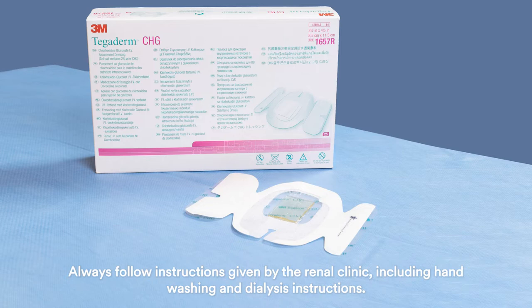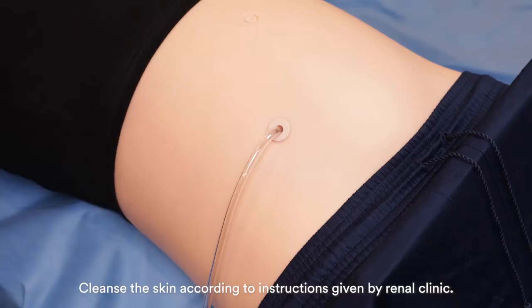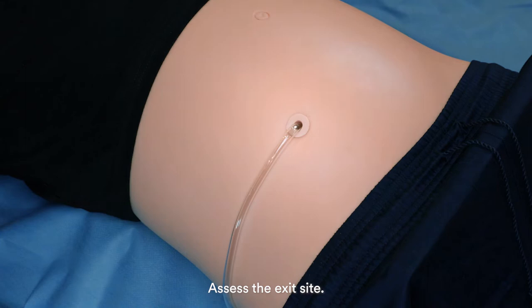Always follow instructions given by the renal clinic, including hand washing and dialysis instructions. To apply a new dressing, first wash or sanitize your hands. Cleanse the skin according to instructions given by the renal clinic.